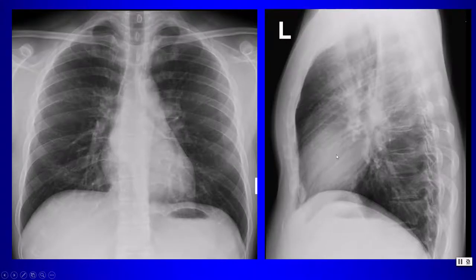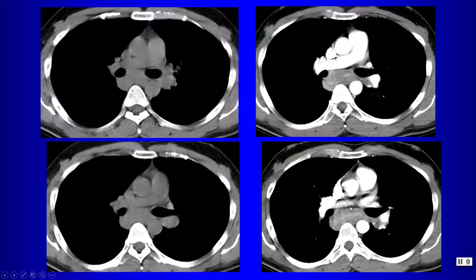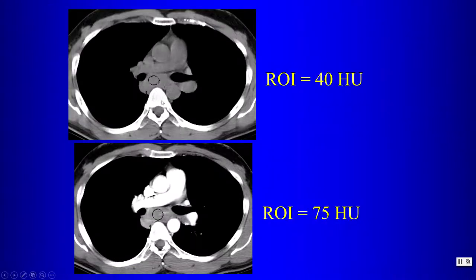On the chest radiograph we see deviation of the azigoesophageal line; on the lateral view there is a vague subcarinal opacity. On CT, the mass might first suggest a bronchogenic cyst, but comparing non-contrast and post-contrast images the mass is clearly enhancing — ruling out a bronchogenic cyst. This was subcarinal lymphadenopathy in a patient with tuberculosis.